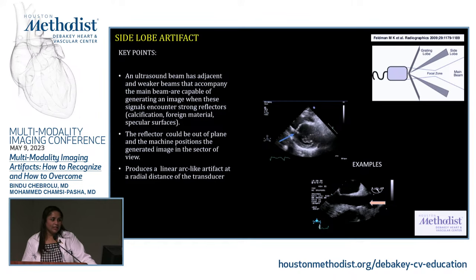All right, so what is a side lobe artifact? I'm sure we have encountered that as well multiple times, right? So when you have an ultrasound beam that produces multiple weaker beams adjacent to the main beam, that's when you can see this, right? It can be out of plane because whatever is reflecting doesn't have to be in the same plane as the original reflector.